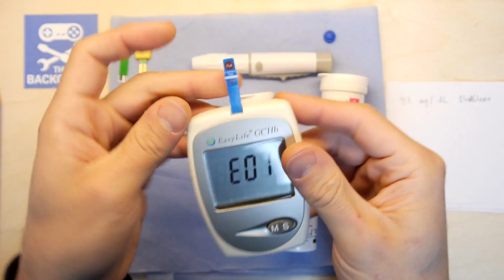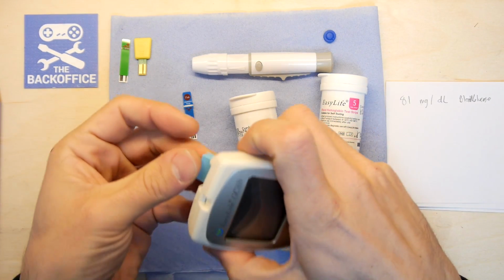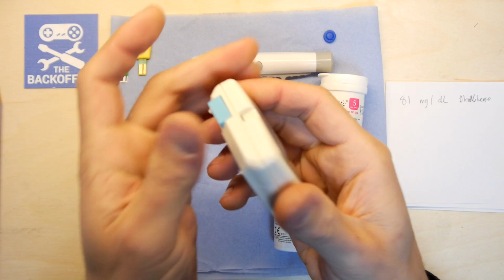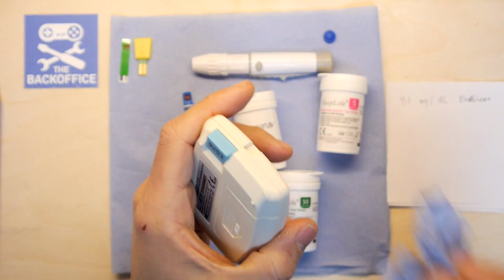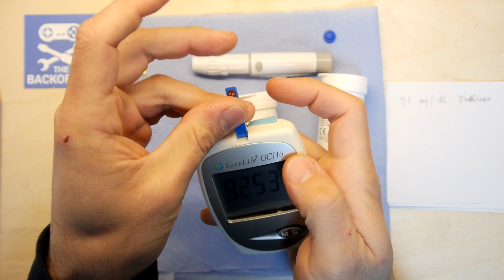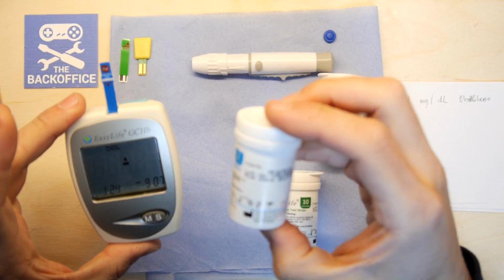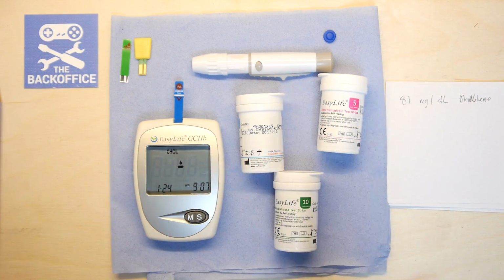E01. Okay, great. That's what happens if you don't put the chip in. Good. Well done, meter. You saved me from my own ignorance. And look, getting blood all over the meter. That's really nice. Yeah, well done. That's just what somebody who's using that wants. So let's check the codes. Well, it came up with a code, but whatever. It did look like the right one.